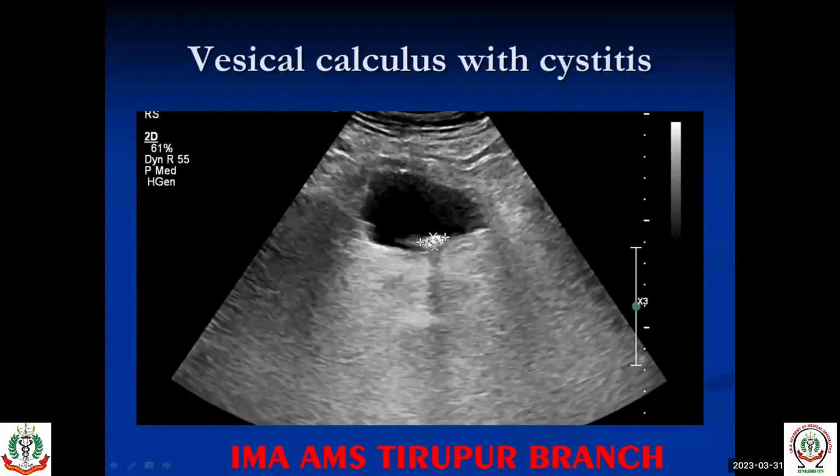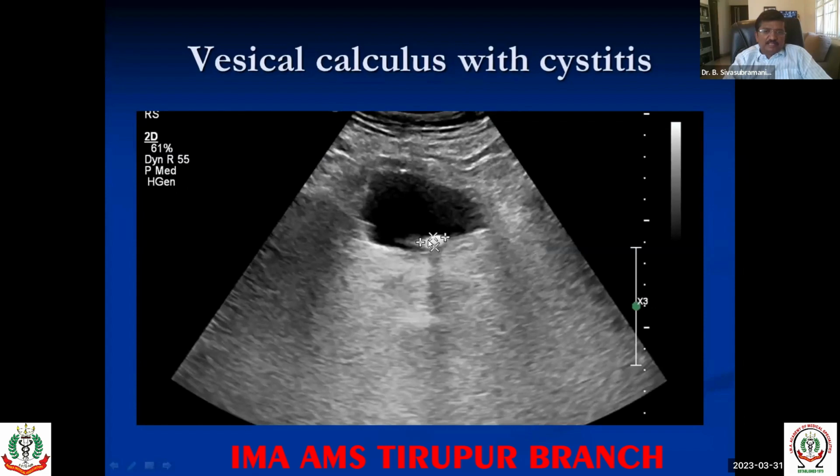Sometimes you have a bladder calculus, because of which there'll be thickening of the bladder wall, and this is a vesical calculus with cystitis, which is another cause for fever.